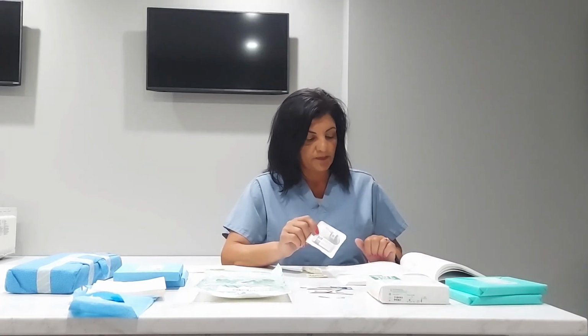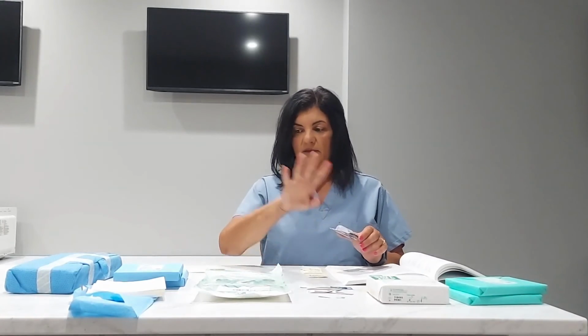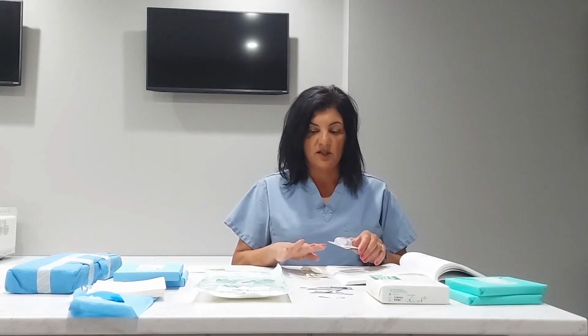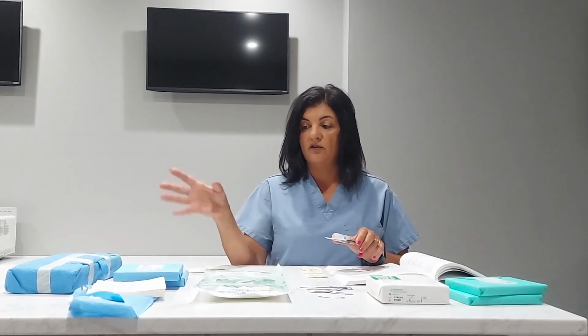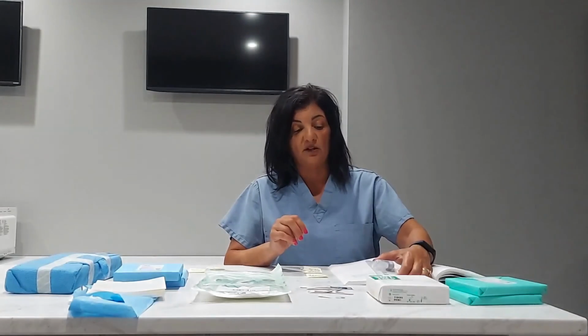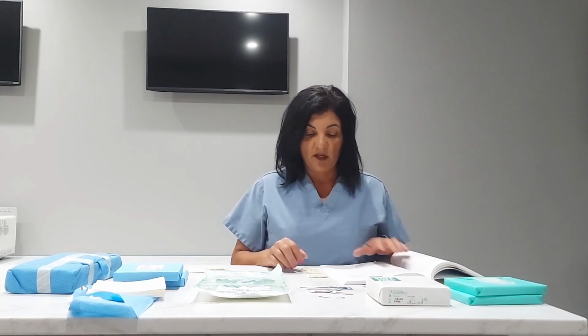So there's a lot of things to know as far as integrator types, process challenge devices, and all the visual cues to know that an item is sterile or not sterile. Always refer to your manufacturer's instructions for use on any products that you use, on the sterilizer that you're running, and the process of the instruments that you're sterilizing. So there's a lot of directions to read and follow, but I know you can do it.